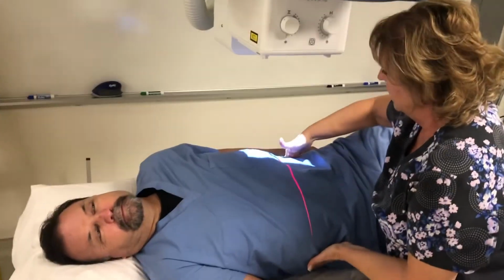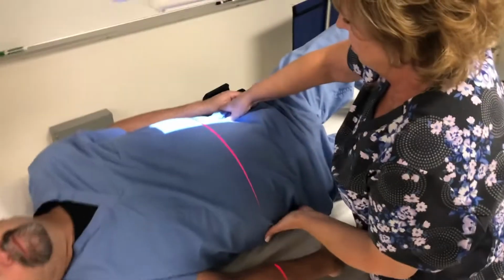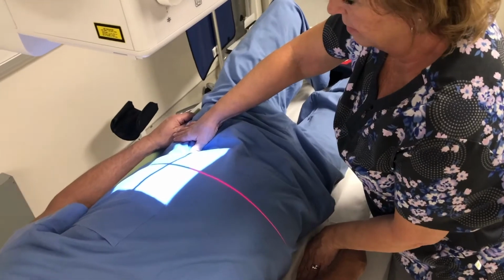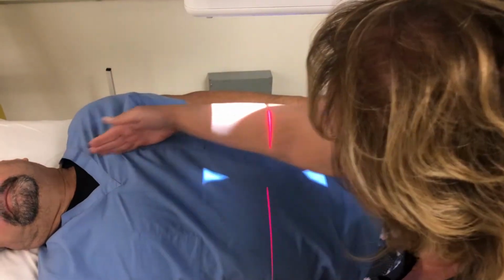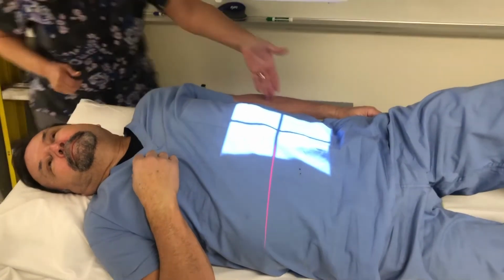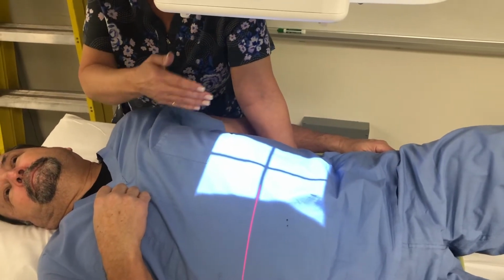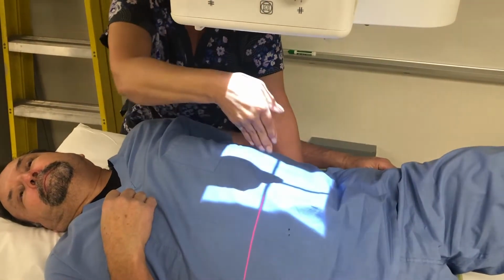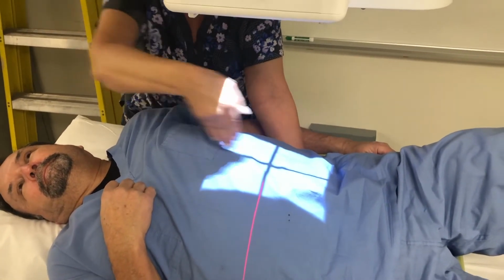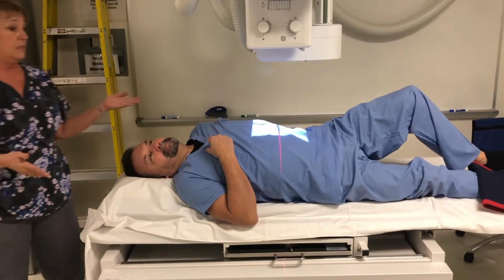I'm going to feel for his crest and ASIS again. So ASIS, I'm going to come about 2 inches medial to that, and that should put me right on line with his spine. If you can imagine reaching under and feeling his spine in the back, where my fingertips end is going to be right on his spine. So it doesn't look like we're centered to mid-sagittal plane, but we are centered to his spine.